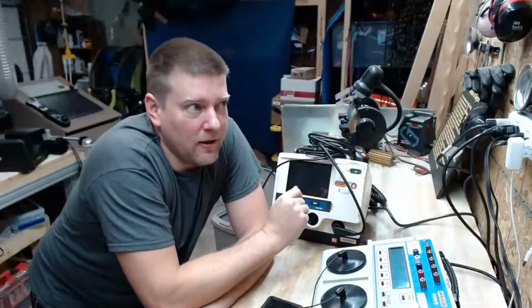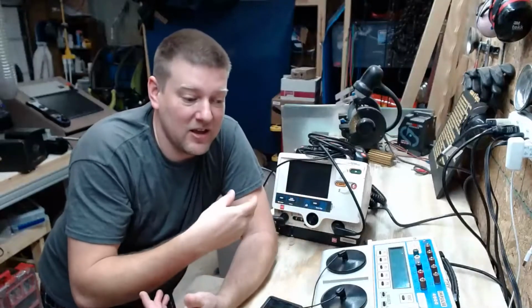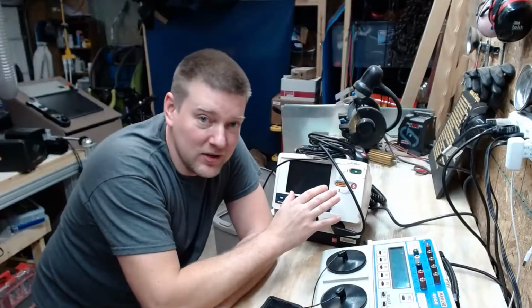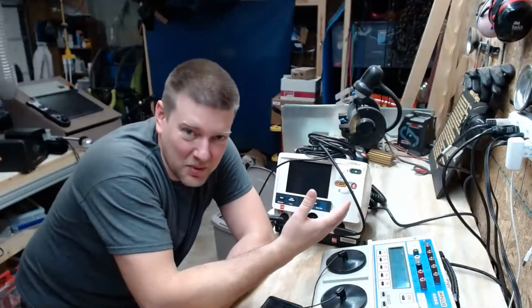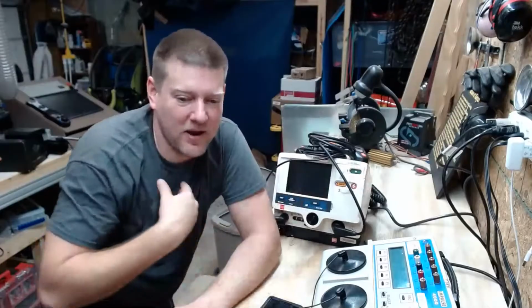If you sign off that something is good and ready for patient use, it is at the moment that you used it and handed it over to them. You can't come back 5-6 months later and ask, who did the last PM on it? It doesn't matter who did the last PM 6 months ago, because anything could have happened to that device in 6 months. But they always try to shove it back on us.